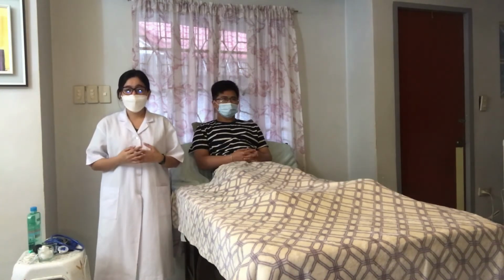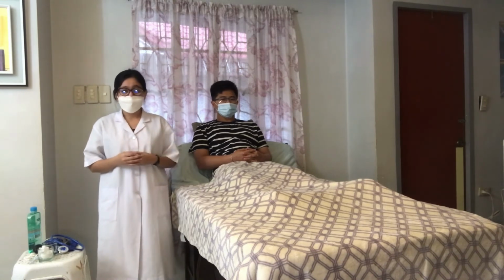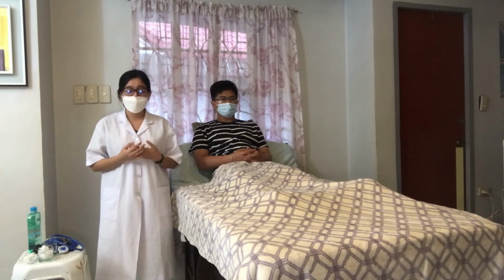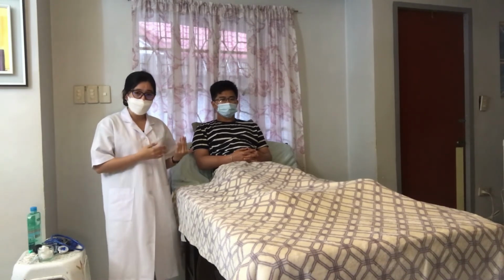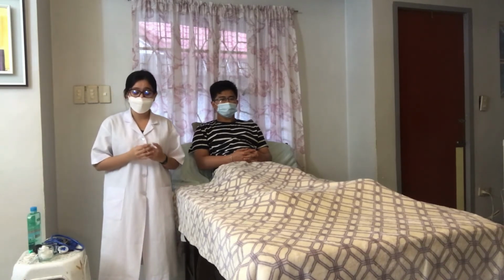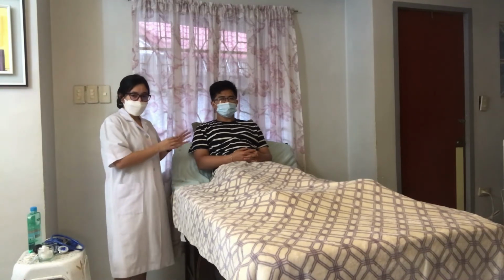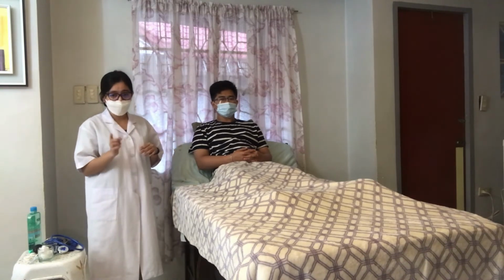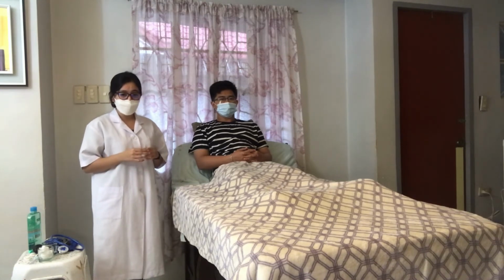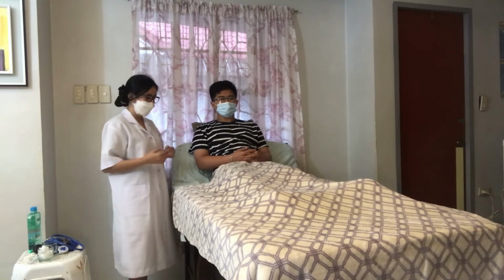So now, in taking the blood pressure of the patient, since we have already asked him if he has done any strenuous activity earlier and he answered that he was just resting, we can now proceed to taking his blood pressure since we no longer have to let him rest for about 10 to 15 minutes. So now, in taking the blood pressure, we must fold the patient's shirt sleeves or gown up to the shoulder, making sure that it is secured and will not fall to the brachial area.